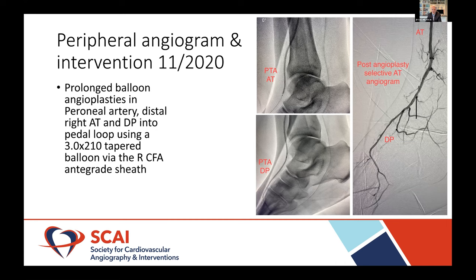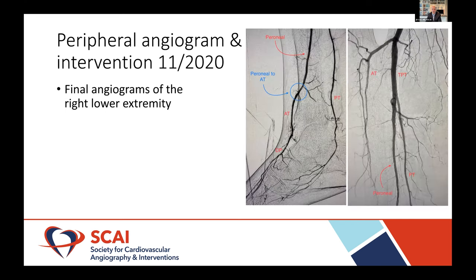You can see on the right panel the selective angiogram through the balloon catheter after balloon angioplasty. Here are your final angiograms from the SFA — you can see that peroneal artery transitioning over to the distal anterior tibial artery through that anomalous connection, down into the dorsal pedal artery around the pedal loop. The posterior tibial artery is still patent.